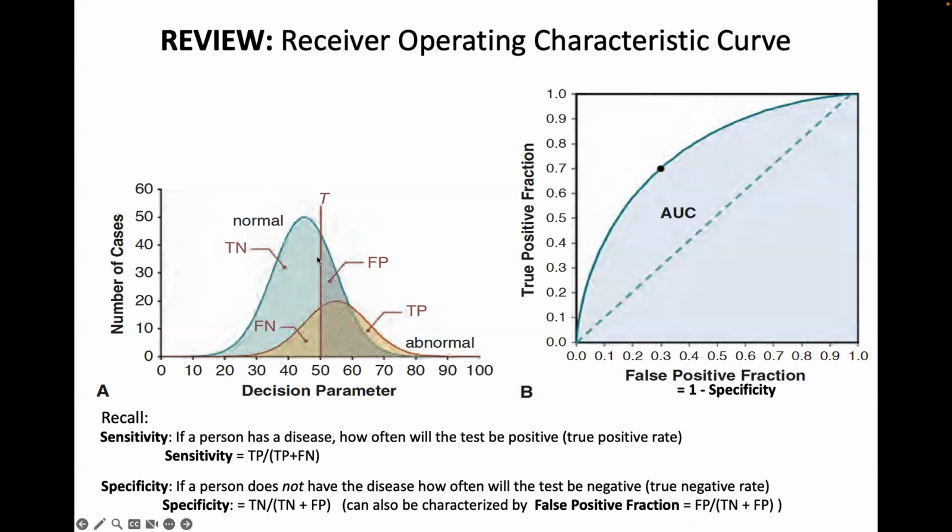So obviously the best thing to have is this histogram. If you're a clinician trying to figure things out, you can get the person's parameter and look at the histogram and say, well, you've got a 50-50 chance probably of being normal or abnormal, right?